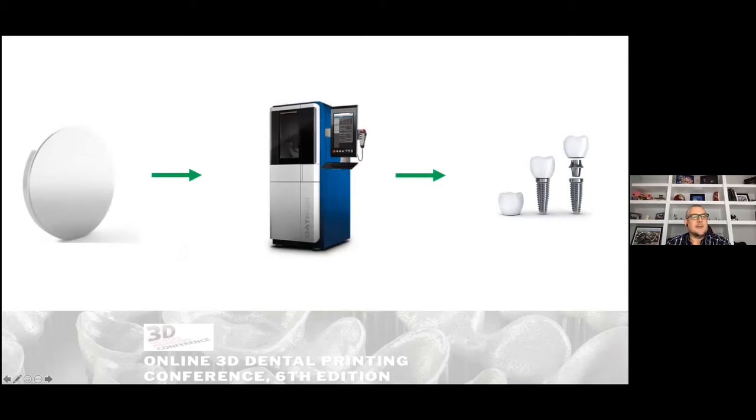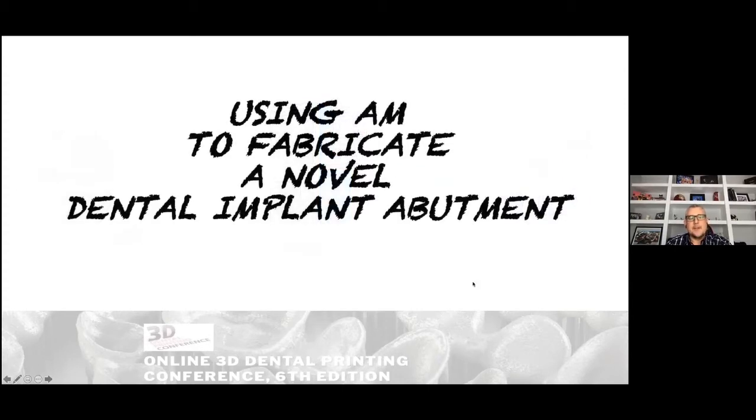In terms of metal, same thing. Okay, taking a metal disc, putting it in a milling machine, and getting out the metal components that we want. So that's the current workflow. This particular topic I'll present is using additive manufacturing to see if we can develop a dental implant abutment. So instead of milling, additive manufacturing.